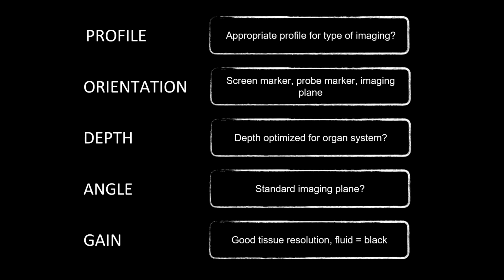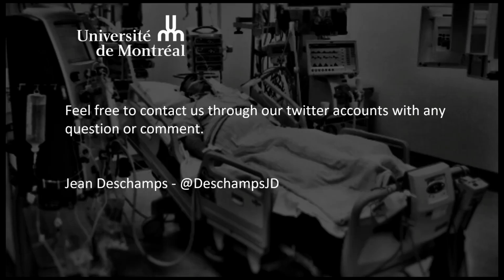In summary, always make sure you look at these things when you're thinking about adjusting your ultrasound to get the best image quality: profile, orientation, depth, angle, and gain. This is the end of this lecture regarding quality image acquisition.